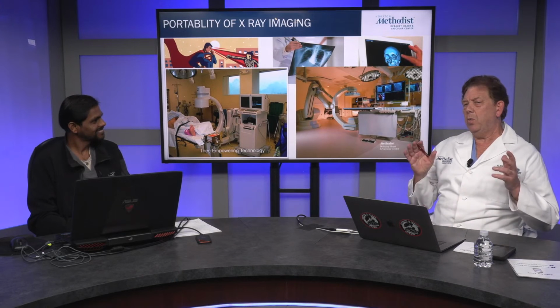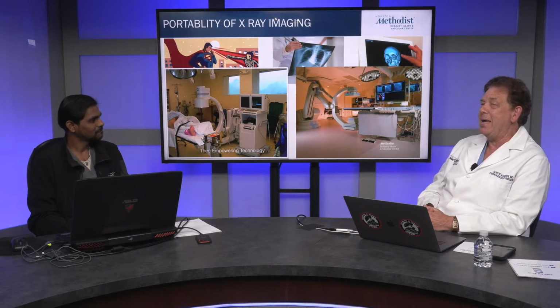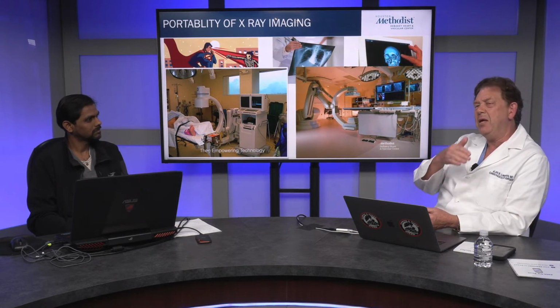Yeah, that's a great comment. For example, we build a hybrid room like the Zeego or the Pheno, and we would say, oh, you want a new angio suite, Dr. Lumsden said, no, I've had an angio suite for 15 to 20 years now. I'm buying a CAT scanner, because that's the new component: the ability to create a cone beam CT image, and that unleashes a whole other host of things like image fusion, needle guidance systems, all of these kinds of things.